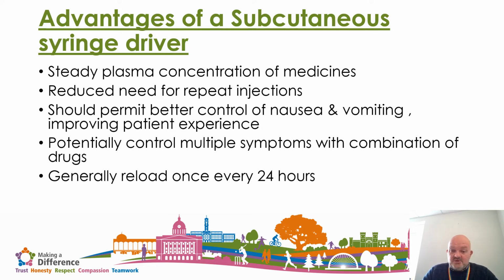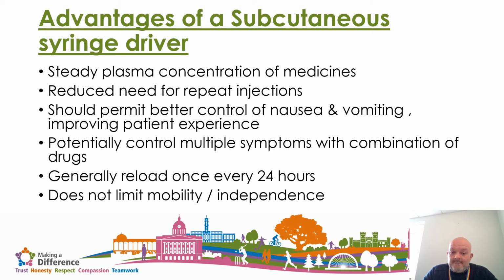And the other thing, from a practical point of view, if everything's working as it should, we only need to reload that syringe driver once every 24 hours. And because of the size of it, if a patient is using the syringe driver just for symptom control and they're otherwise up and about, then their mobility is not going to be affected, because the syringe driver that we use is easily tucked into a pocket or a bag, so the patient can continue to be mobile and independent.